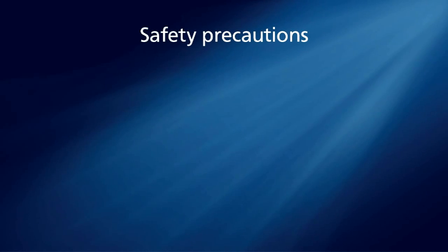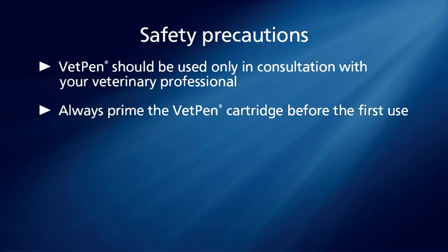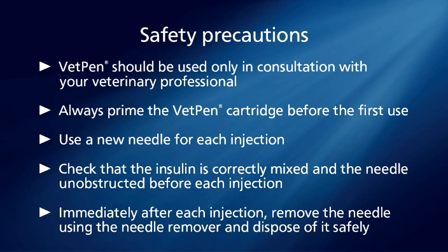Please follow these safety precautions when using Caninsulin VetPen. VetPen should be used only in consultation with your veterinary professional. Always ensure that the VetPen has been primed before use. Failure to prime the VetPen could result in inaccurate dosing. A new needle should be used for each injection. The needle is designed for single use and should be removed with the needle remover and safely disposed of immediately after each injection.